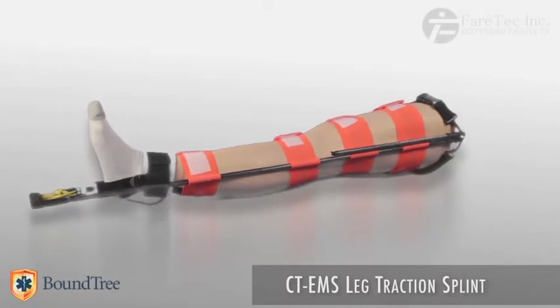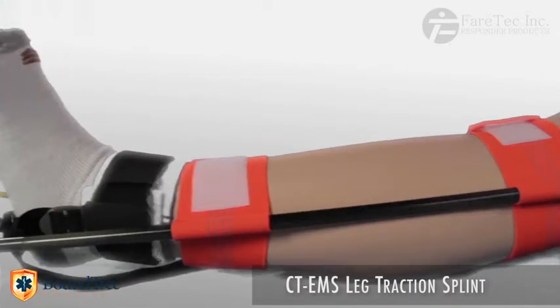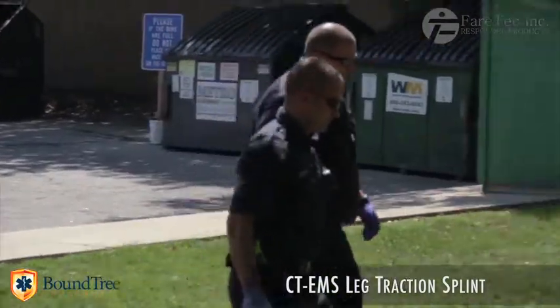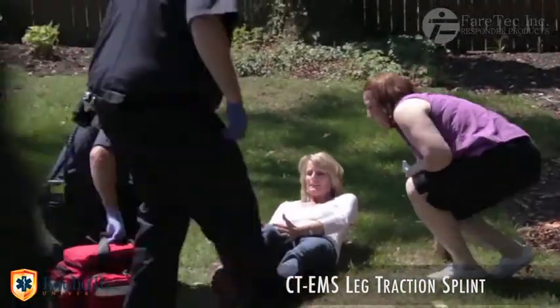Introducing the CT-EMS Carbon Traction Leg Splint — a splint to solve your leg traction needs in a small one-pound bag. The CT-EMS Carbon Traction Leg Splint has been designed to stabilize all-sized patients with femur fractures.